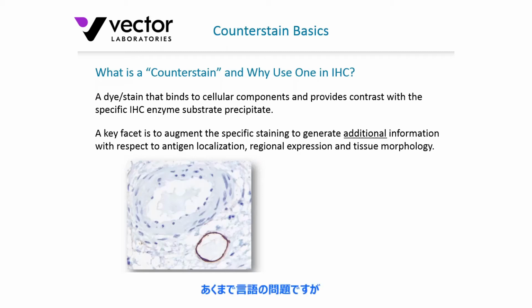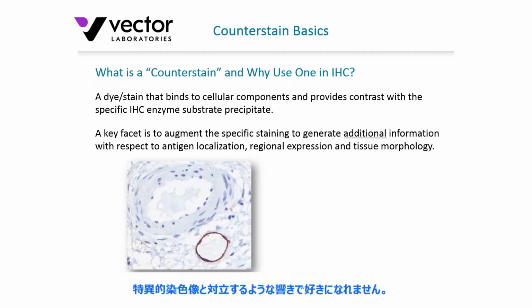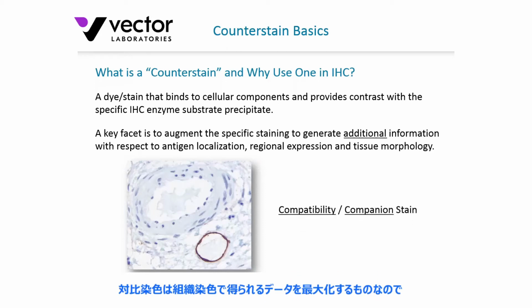Now, I'm not a particular fan of the phrase counterstain, and I think this is probably a shortcoming of the English language. To take a counter position is to take an opposing position, or an opposite position from what is presented. And I don't like the idea of the counterstain being opposing necessarily to the specific stain. I like to think of them more as compatibility or companion stains, to work in concert with that specific staining and maximize the data you can get from your tissue section.